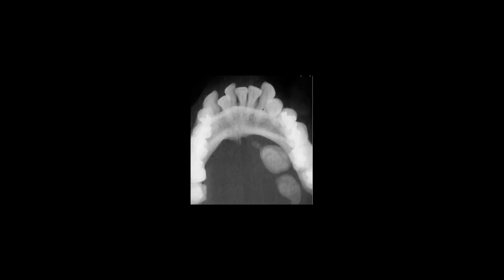With the mandibular occlusal, they tend to be much more parallel, because you can put the film in your mouth and you can put the X-ray cone right underneath your chin and you can shoot it up at an angle. And of course, the value of that is that you can see the position of unerupted canines that are buried within the mandible. Now, you will sometimes position it into different angles under the mandible such that you can catch and pick up these giant sialoliths, as you can find sometimes, as I will show you there.